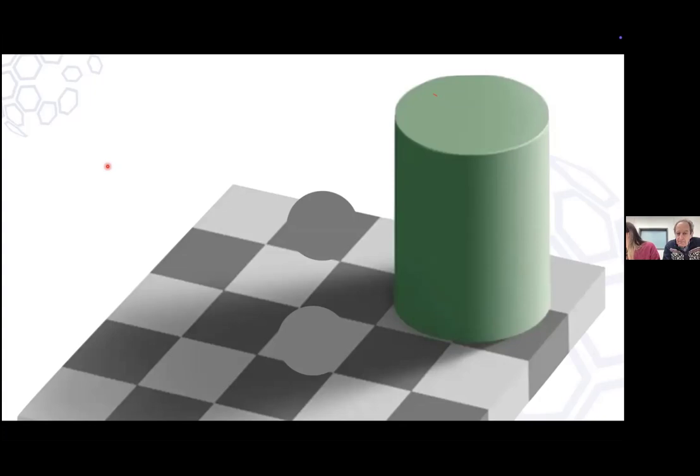And the last one, talking about optics and resolution, do you think HER2 low, ultra low can be diagnosed confidently by AI? Some of the very weak staining can be confused with artifact on scanned slides. Yes, so this is a very good point.